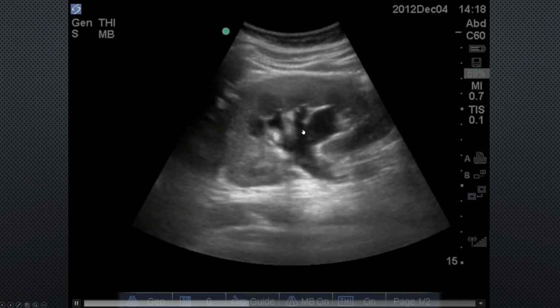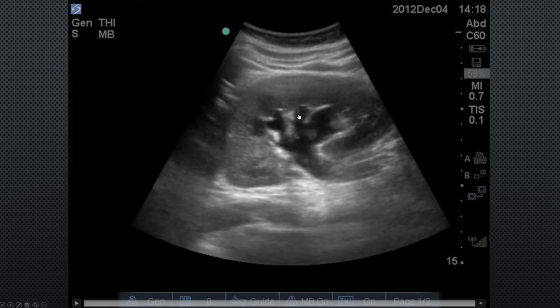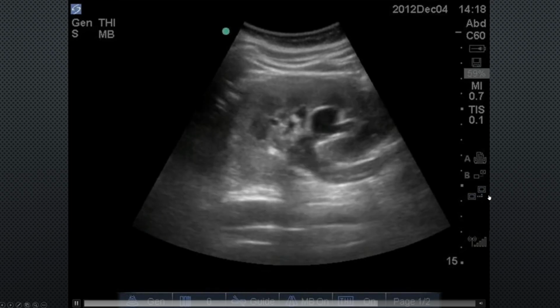Here's another one. Hydro going in, that hypoechoic going into the calyces. So we would rate this as a moderate amount of hydronephrosis.